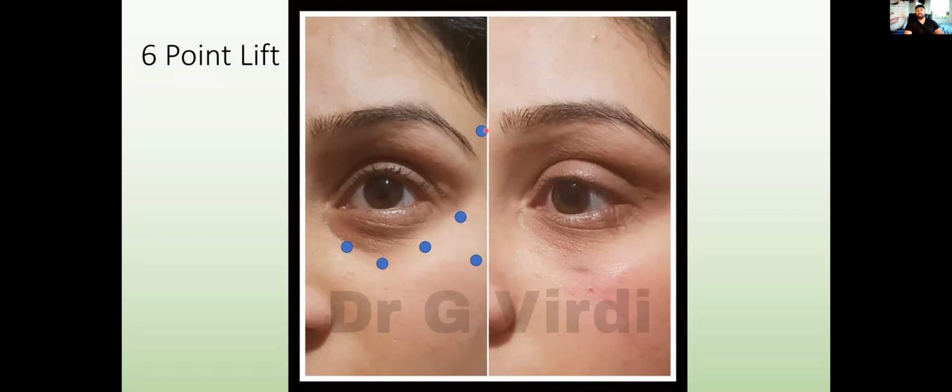Your fifth injection will be here. Now, as you can see here, from the medial canthus to the lateral canthus, it's ever so horizontal. Now, to get rid of this tired look or the sleepy look, what we can do is elevate this lateral canthus by injecting onto periosteum a small amount of product here, which will then help support the lateral canthus.